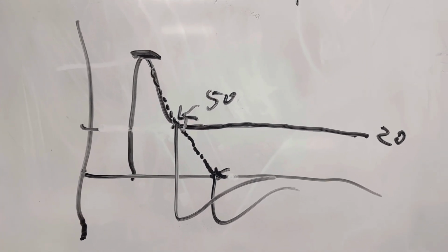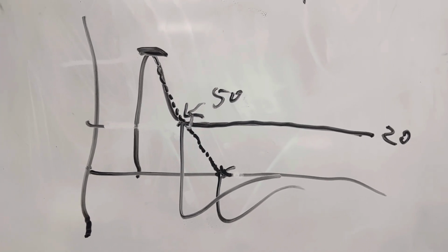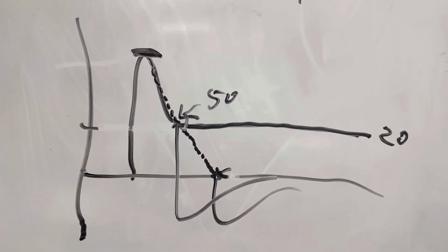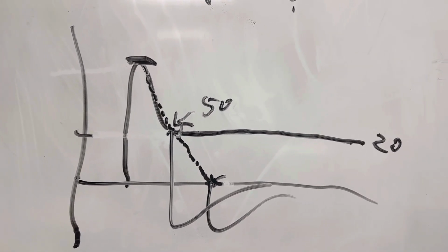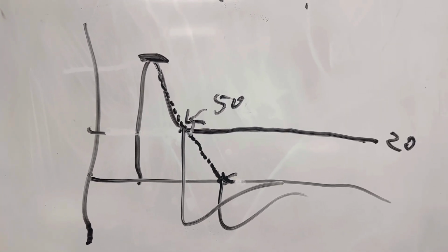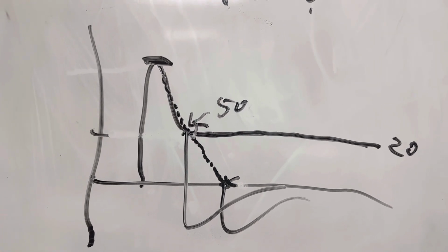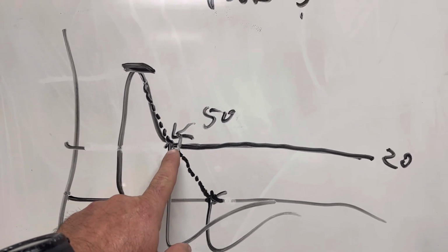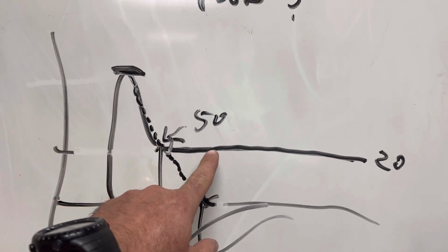If this leak is fixable, by getting a bigger tube or putting a cuffed trach in, then that's really what we want to do in the ICU. We want to fix this. We don't want this occurring if we can get around it. Now, if the physician can't fix the leak for whatever reason, then we're stuck with not wanting this elongated I time. So we would adjust our inspiratory cycle up until the point where this straight line occurs.